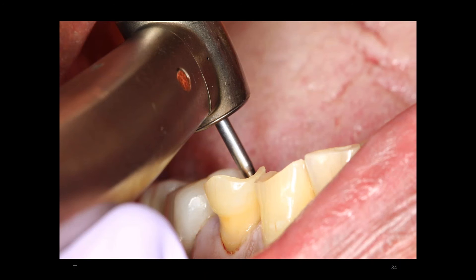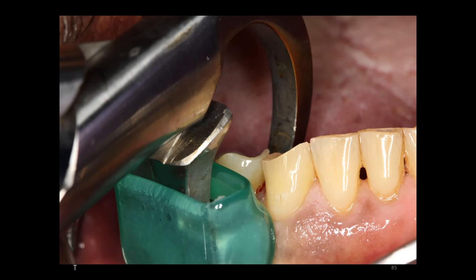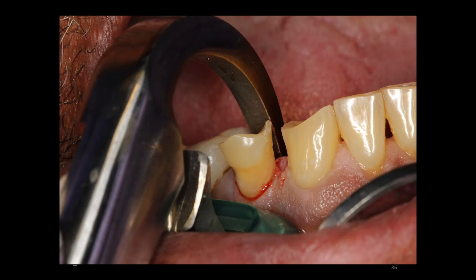We'll take my tooth delivery instrument and remove the tooth in total. I'm going to curette the socket, remove any granulation tissue, any purple blood. Red blood is great, purple blood is bad. So curette the socket.